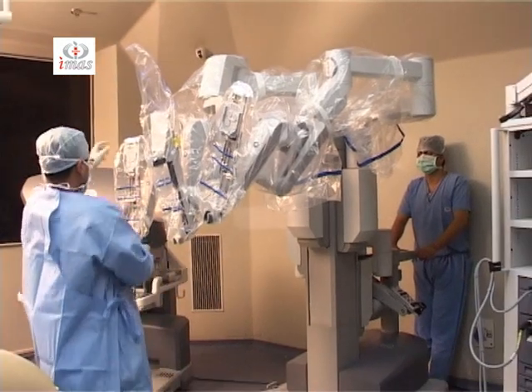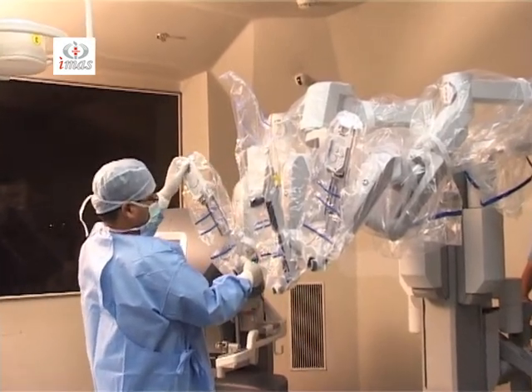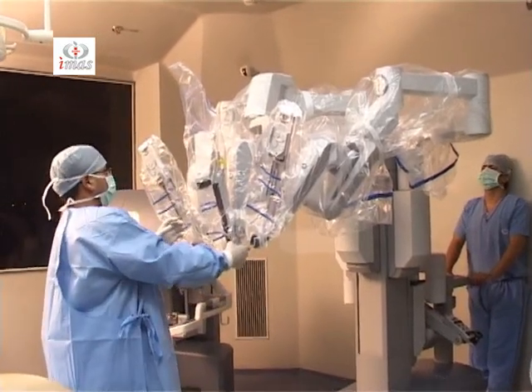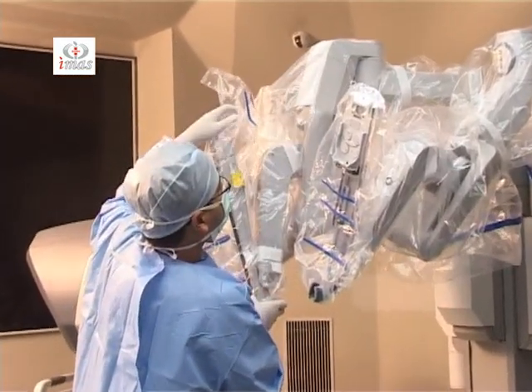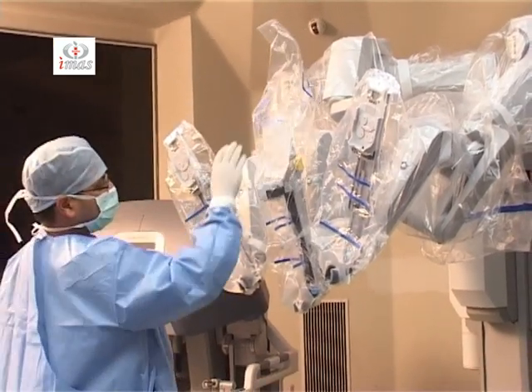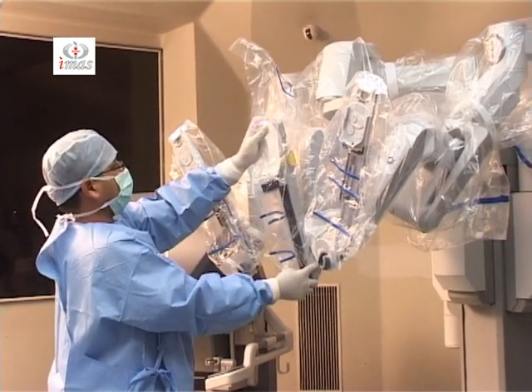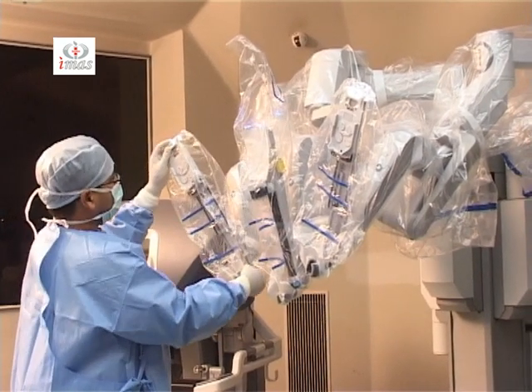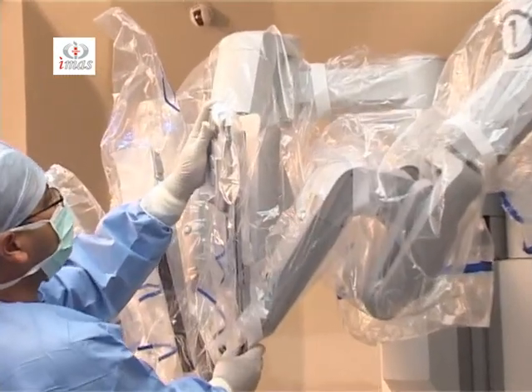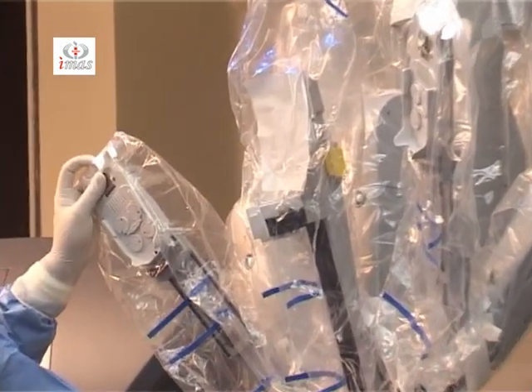Now I'll position the cart for docking. To position the cart for docking, you have to see that the sweet spot is aligned. The camera arm and the center column are aligned in the same direction, and this has to be taken care of by using the clutch button. And these numbers 1 and 2 are facing your side, and these are making an approximate angle of around 45 degrees to each other.